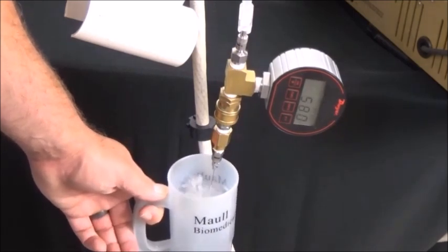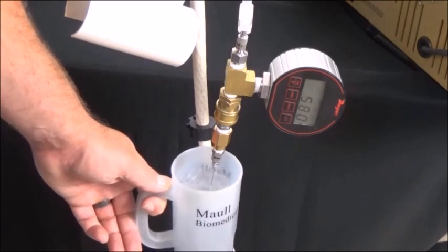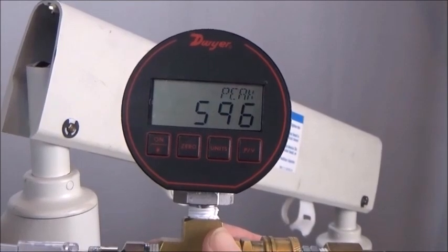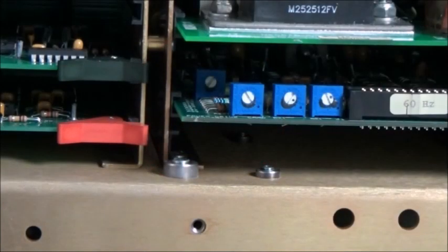When the injection is complete, record the peak psi reached on the pressure gauge during the injection. The pressure should be 600 psi plus or minus 30. If necessary, adjust R17 on the PDC board and repeat.